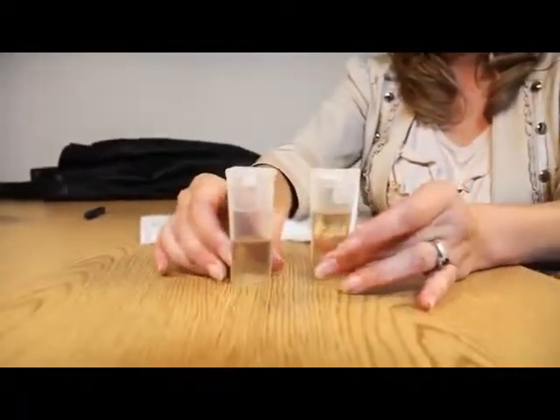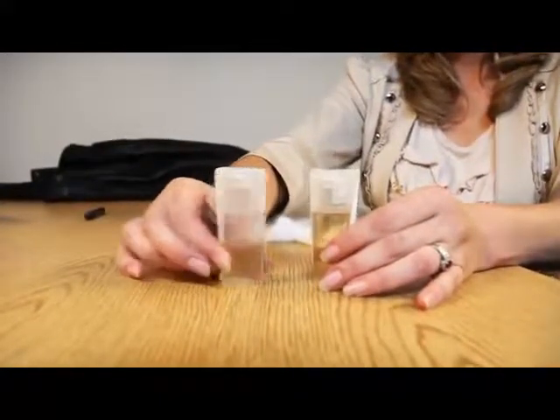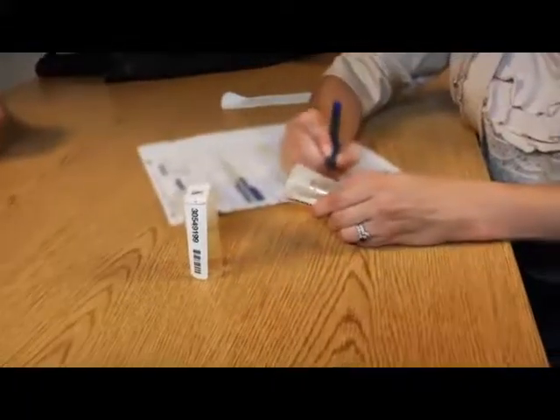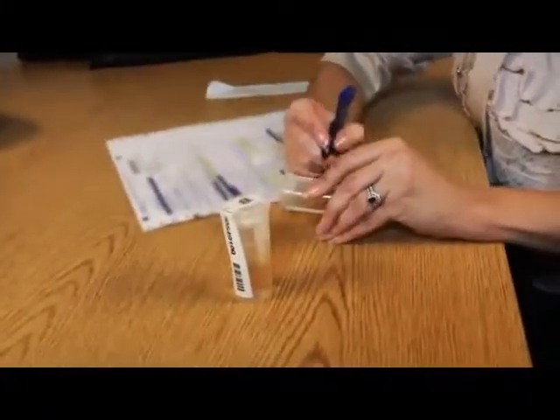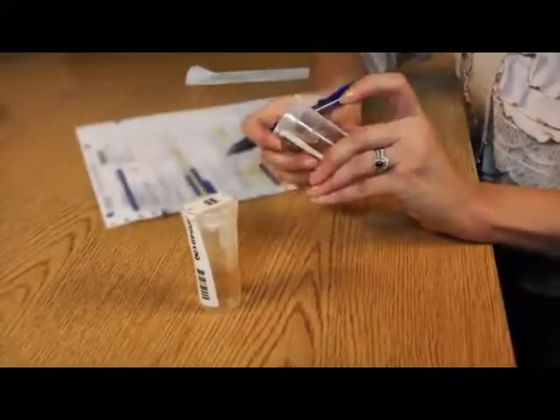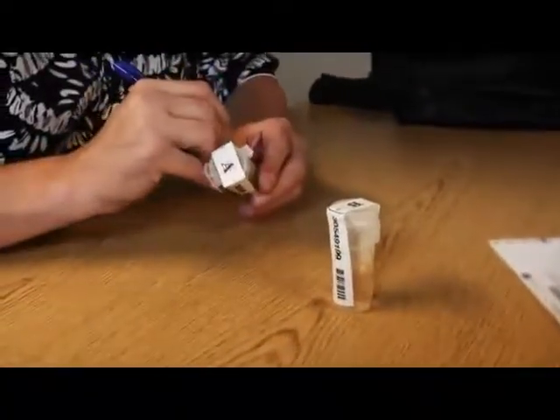The seal must be centered over the lid cap and down the sides of the bottle to ensure that the lid cap cannot be removed without destroying the seal. The collector, not the donor, writes the date on the seals. After the seals are affixed to the specimen vials, the donor is requested to initial the seals. The donor must be present to observe the sealing of the specimen bottles.